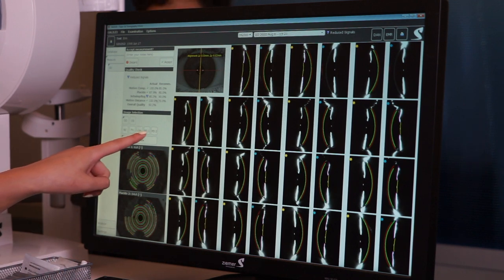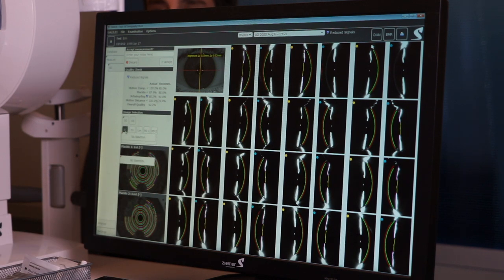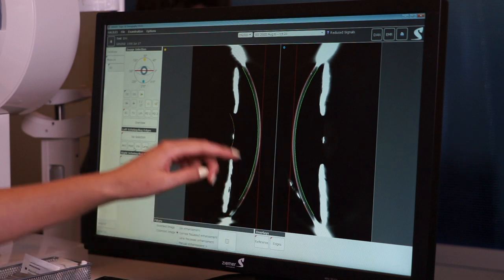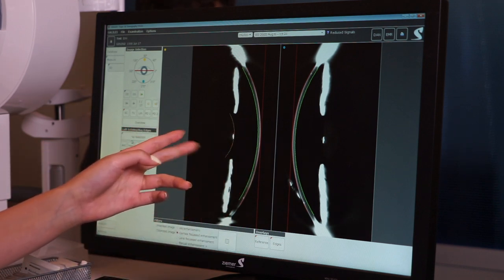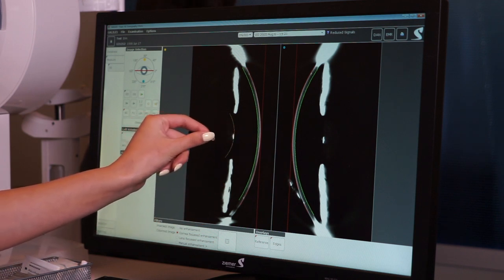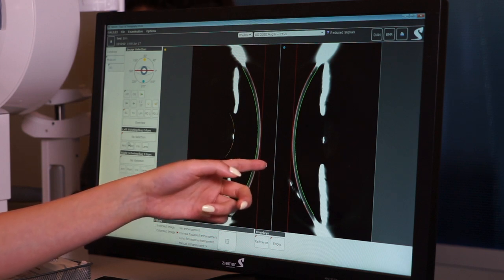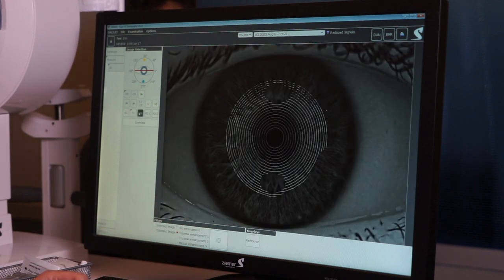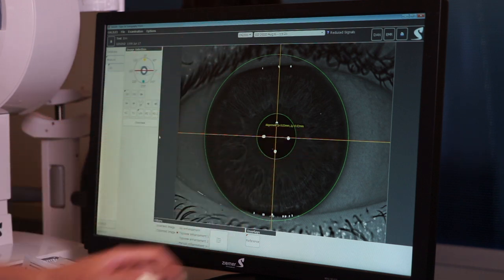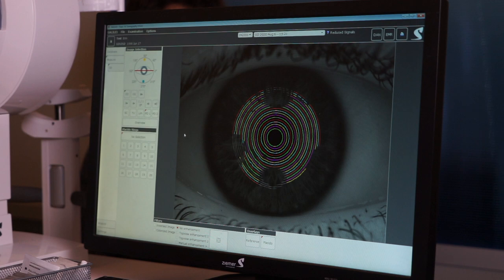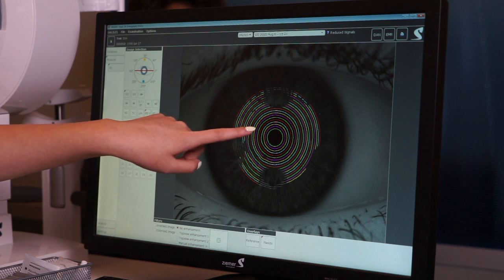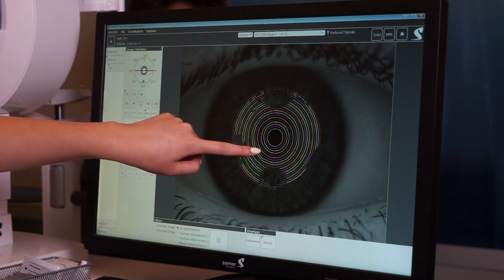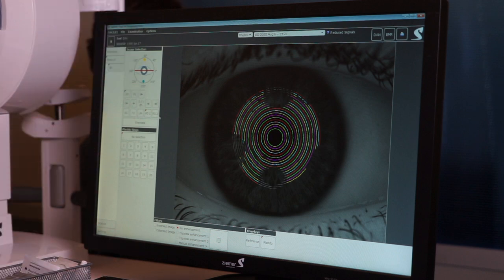Go through each of the criteria buttons and make sure all criteria are met. Starting with the first one, you want this light gray band to be just touching the red line — the threshold is the thickness of the gray band in either direction, but just touching is ideal. Next is alignment — make sure it's aligned to center. For the circle views, make sure there are no breaks up through the second green circle; breaks outside that are fine. The last view is just another image of the same check.